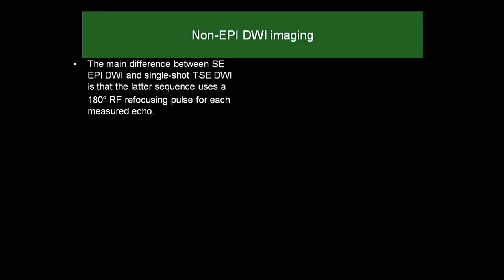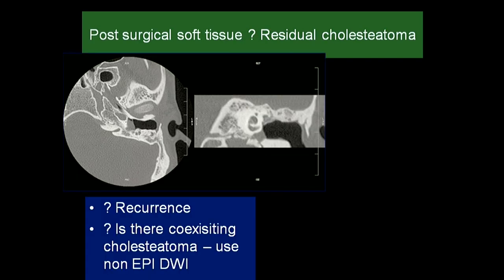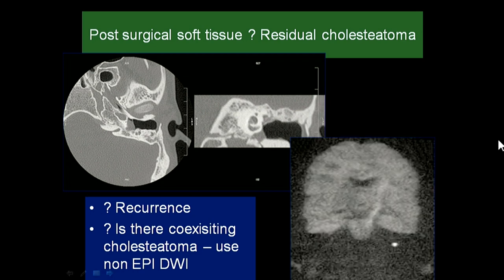Non-EPI diffusion-weighted imaging (DWI) has been promoted as a technique to detect cholesteatoma when uncertain. This is called non-EPI-DWI — Turbo Spin Echo DWI in Siemens, PROPELLER in GE, and there are published papers on this. Here is a post-surgical patient with residual soft tissue where it is difficult to determine if cholesteatoma remains. On non-EPI-DWI, diffusion restriction is seen, giving confidence to confirm residual cholesteatoma.